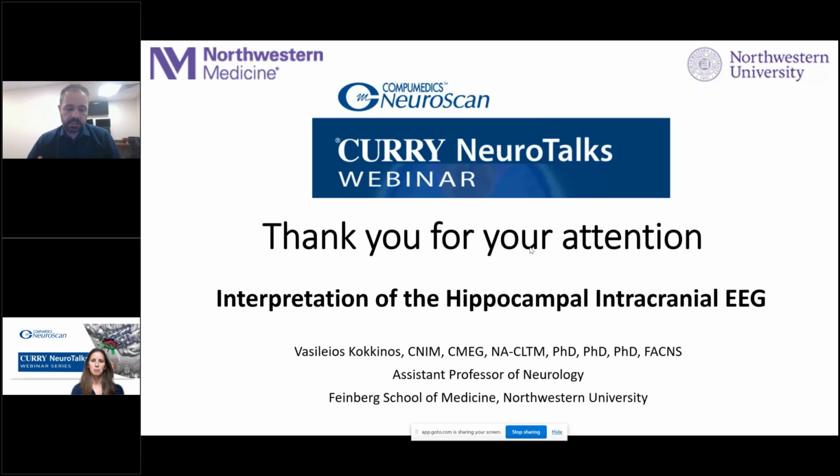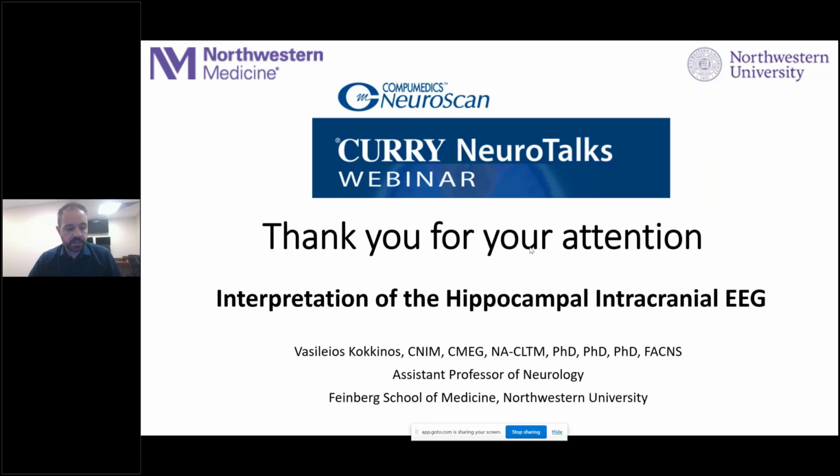It's like the way that we understand epileptogenicity: it is virtually impossible for an area that has been involved in generating seizures chronically, throughout years, to have a really normal background. When you appreciate a background that is abnormal, even without having a seizure, this is an indication of that area being definitely abnormal. And why is that important?